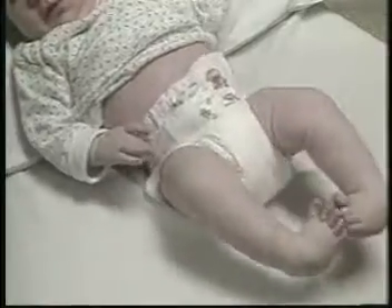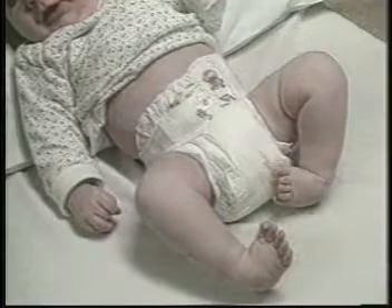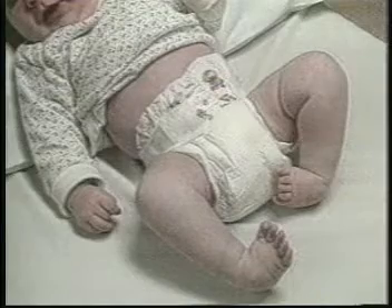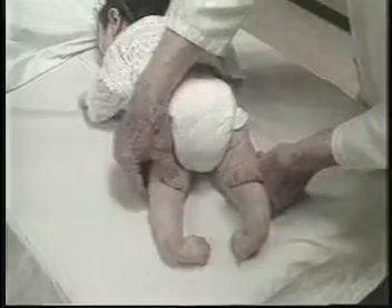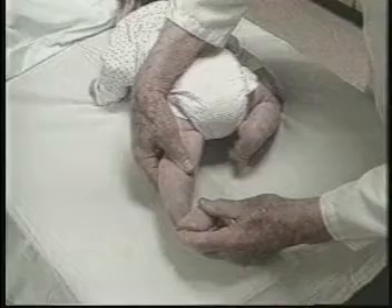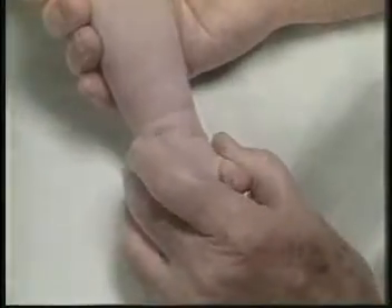Isabella, a two-and-a-half-month-old baby with severe club feet. After five plaster cast changes applied by their doctor, the parents were told that the baby would need surgery. The baby's feet are in severe equinus, cavus, adduction, supination, and the heel is in varus. There is a deep crease on the inner aspect of the feet. The ligaments and tendons are very tight, allowing for little correction at the first manipulation.